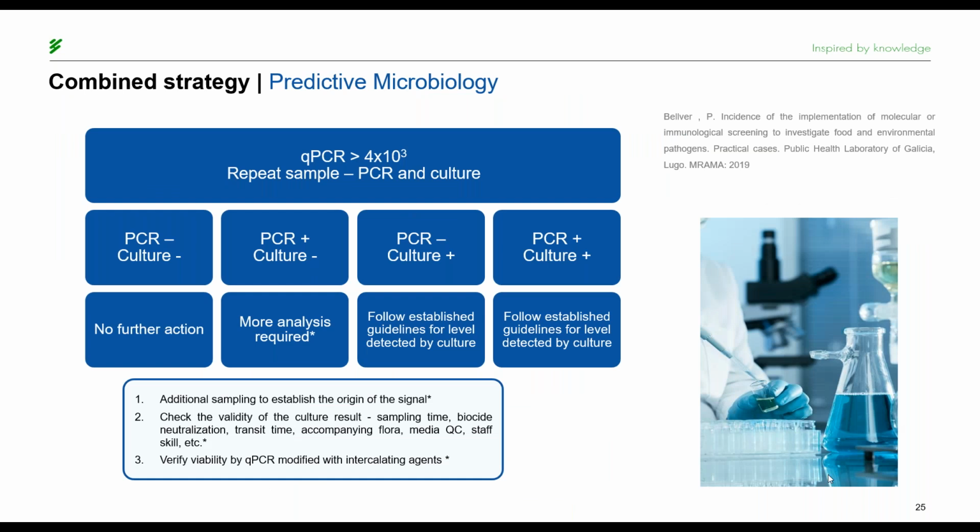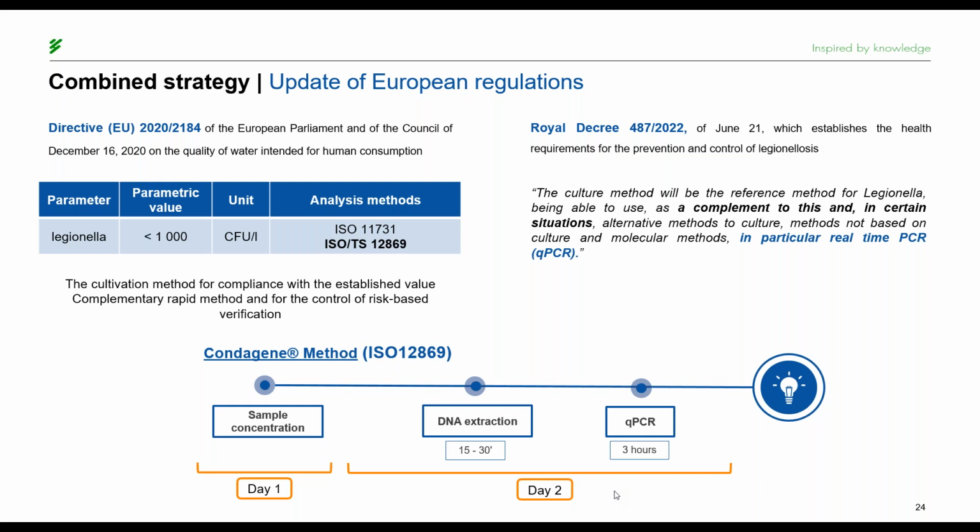So how could this be implanted together with microbiological culture, because it is not yet quite clear. As you can imagine, the regulations are open to someone understanding one thing and somebody else understanding something completely different.